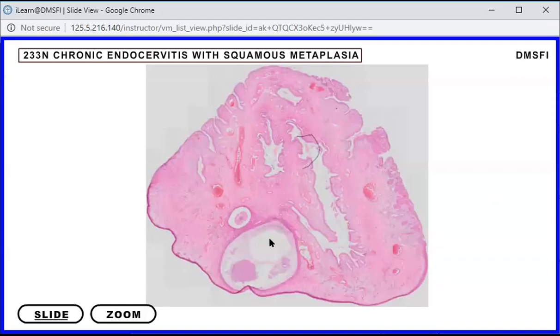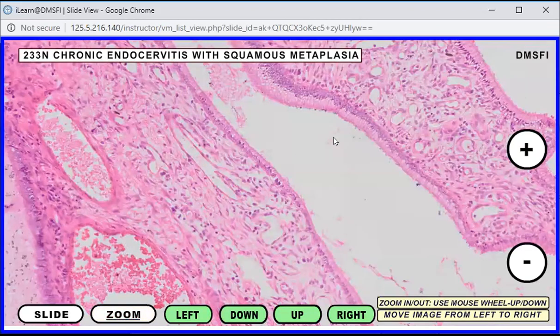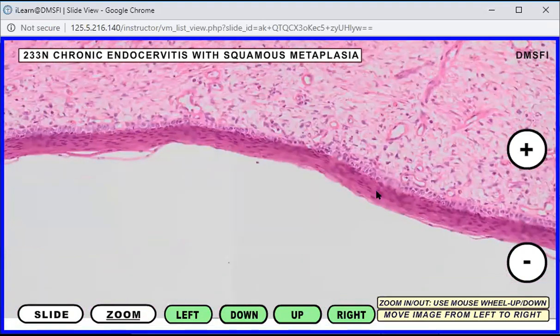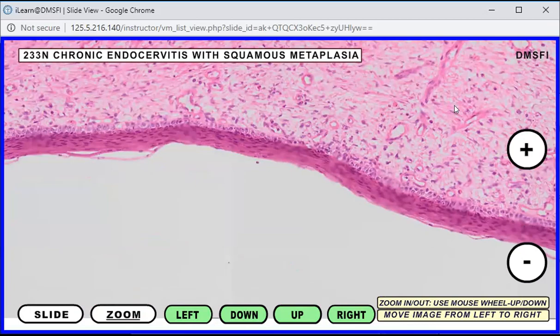So for squamous metaplasia, we have this cervical tissue. When you talk about metaplasia, this would be a reversible change that occurs when there's a transformation of one cell type to another cell type. Usually this is due to a coping mechanism for stress. Looking at the cervical tissue, we have two lining epithelia present: the mucosecretory columnar epithelium which lines the endocervix, and the ectocervix lined by stratified squamous epithelium.